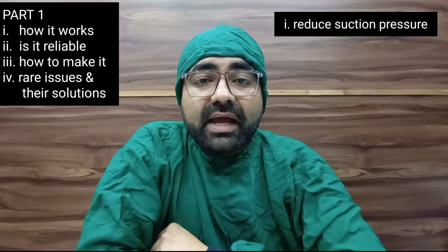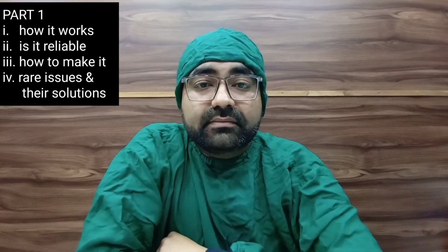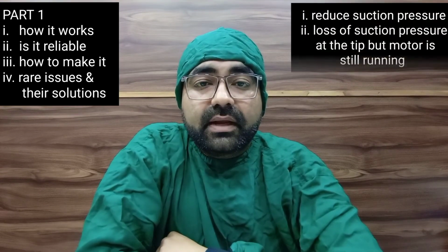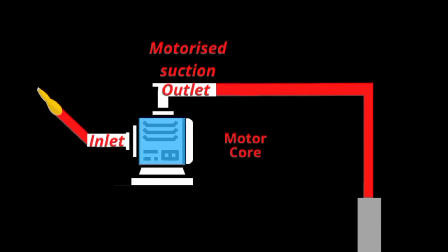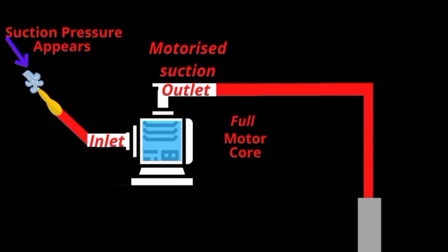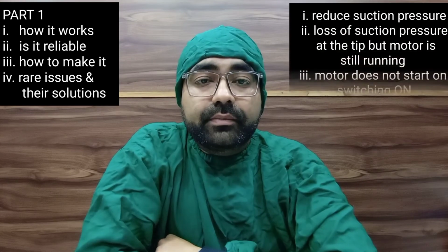This problem may arise depending on the use and quality of your suction tip. Second, loss of suction at the tip, but the motor is still running. This happens because the core of the motor is completely empty of the liquid and cannot create vacuum to pull out more liquids. To solve this issue, just put some water into the inlet pipe and your suction pressure will appear again.